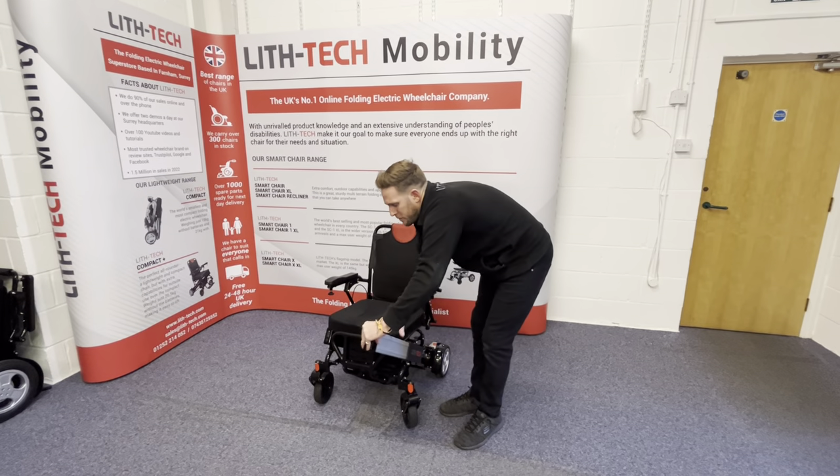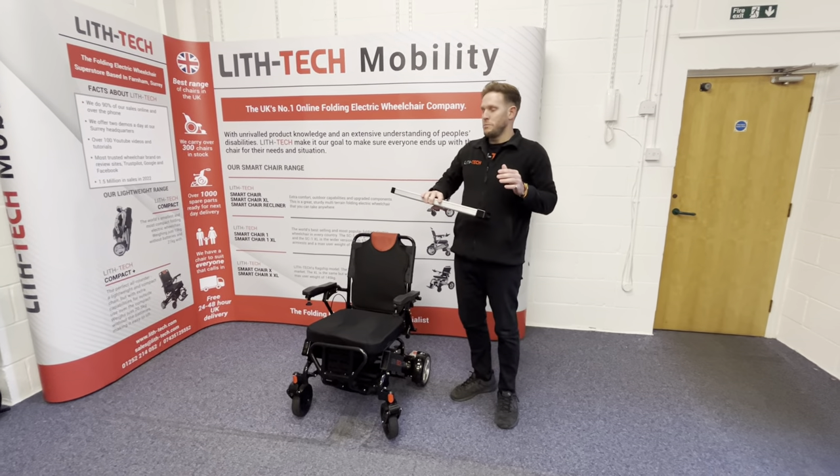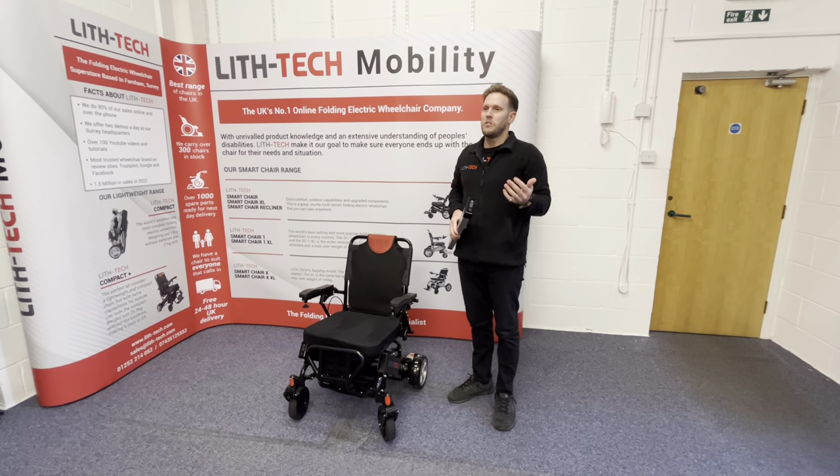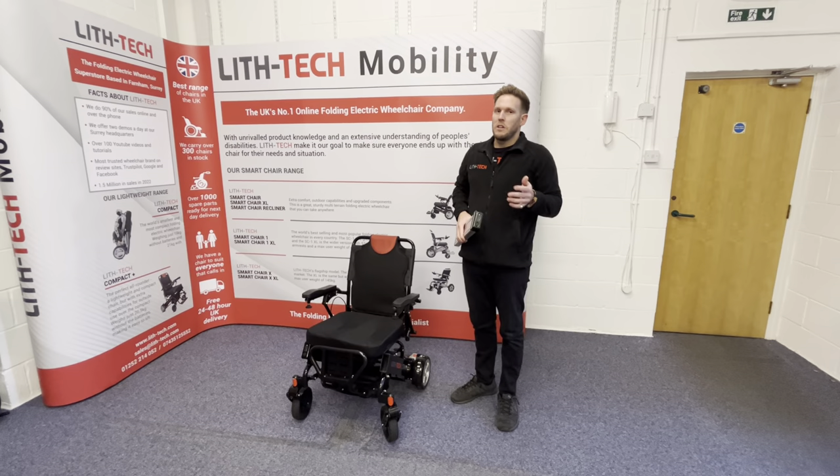Two 6Ah batteries, safe for every airline in the world. You've got a treadmill range of 15 miles, so a real-world range, depending on your height and weight, of around 9, 10, maybe 11 miles. It really depends on terrain.